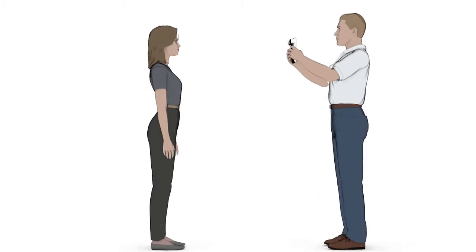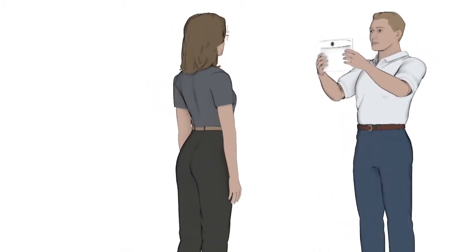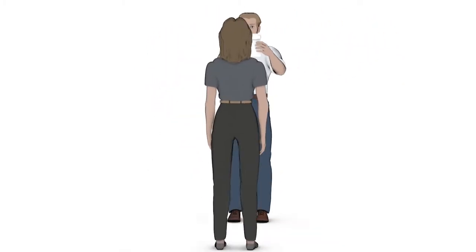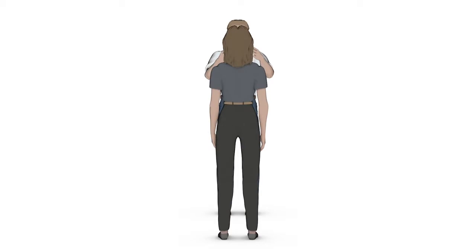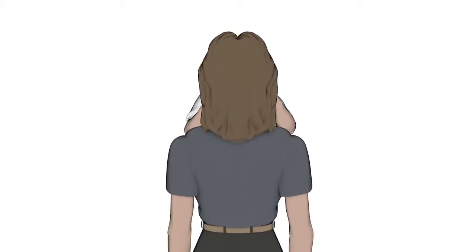Make sure that the patient has a natural head and body posture during the measurement procedure and also aligns his line of sight and body to the optician.